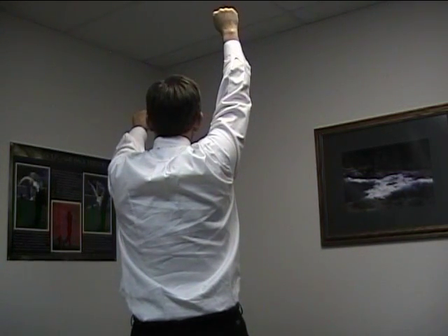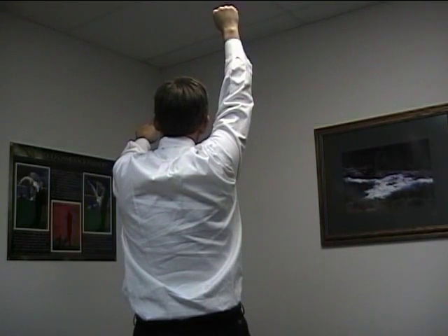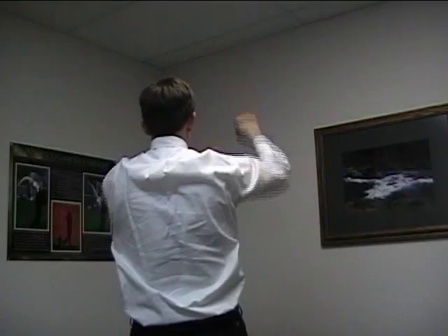As my back is to the camera, or to the door, I'm going to be stretching my top arm back to try to get better mobility in the shoulder itself. So those are the two positions with that. I'm now going to show it sitting down. I think I'll be okay on sitting down too.